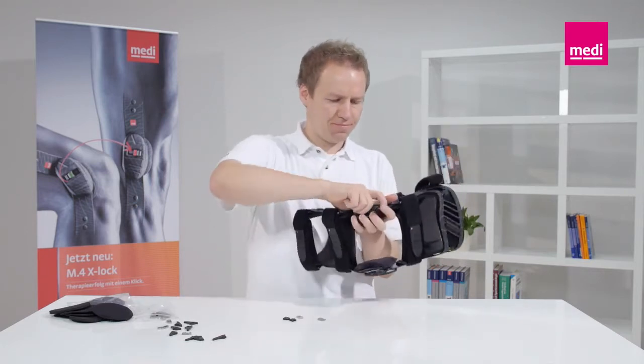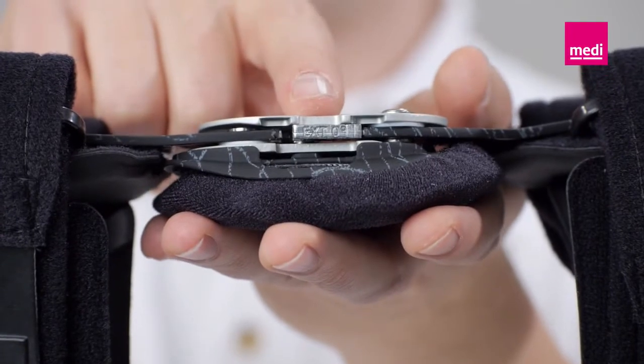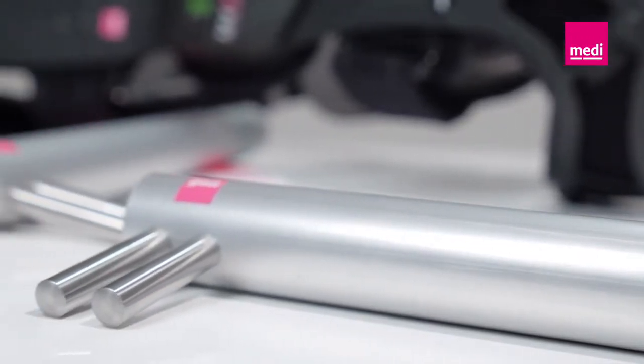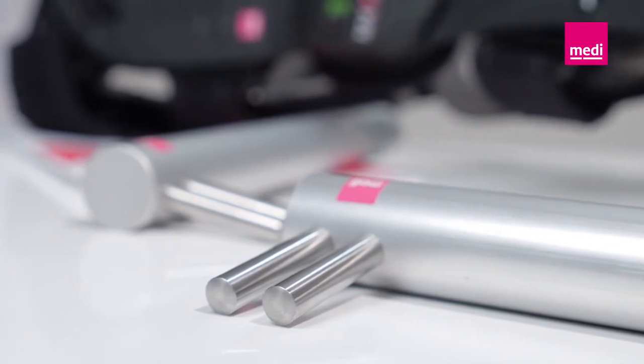Only the technician treating the patient may change the extension and flexion limits. In order to avoid hyperextension, extension wedges or zero-degree wedges must always be inserted. If necessary, the wedges can also be changed while the patient is wearing the orthosis. The METI bending tool can be used to help mould the orthosis closely to the patient to guarantee the best possible fit. This prevents painful pressure areas and guarantees the best comfort in wear.